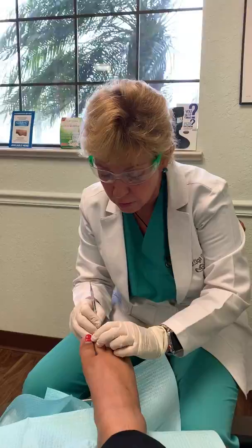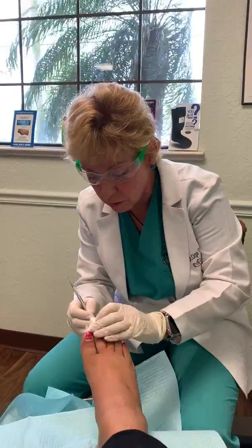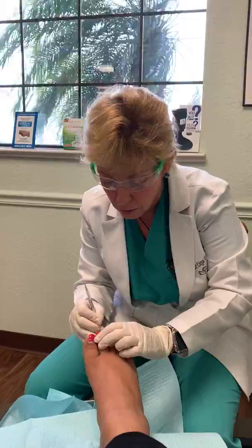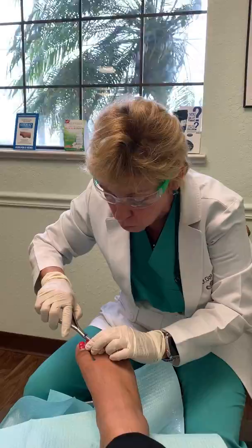Now I'm just curating the corners to see if there are any little spicules — any little pieces of nail left in there that could be causing problems or offending the border. This looks awesome, it's nice and cleared up. I'm going to take out a little bit more of that corner because there's still a little piece causing problems — and there we go.